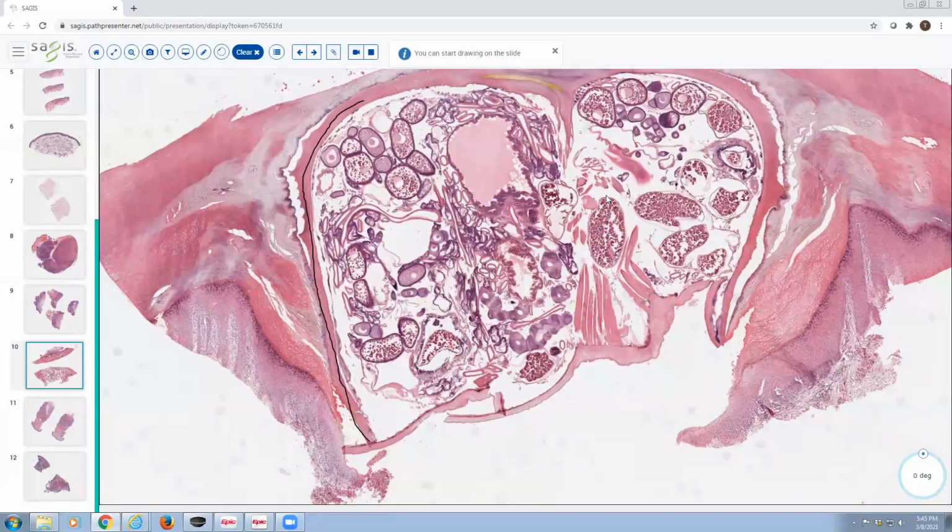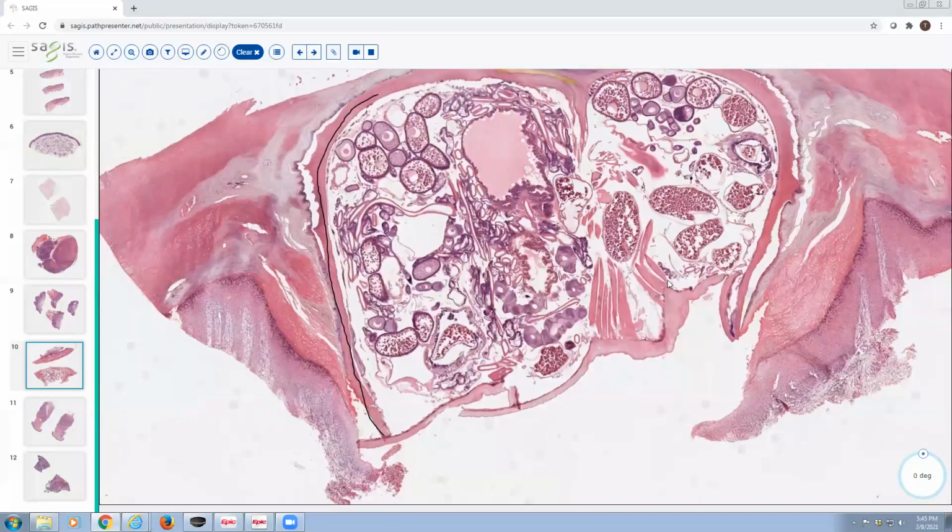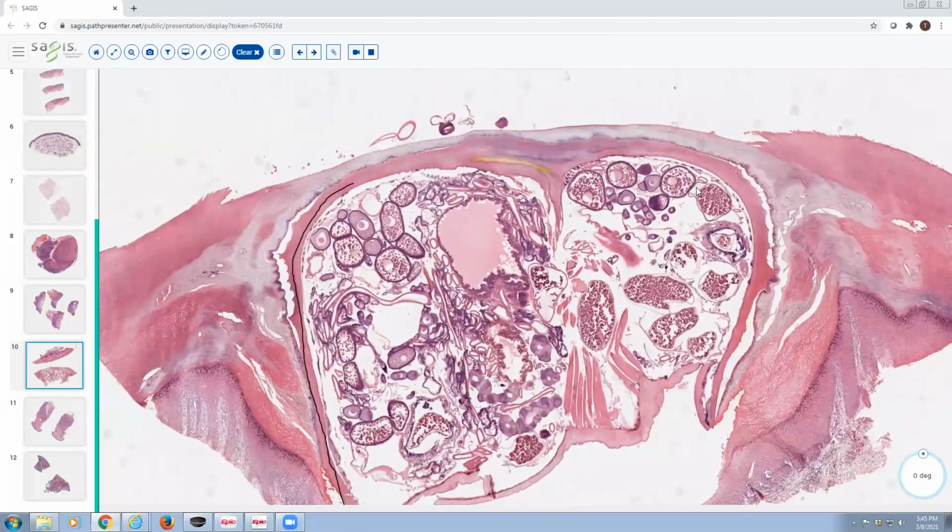So when I'm trying to distinguish this from myiasis, for example, or scabies, I worry less about what's on the inside than I do where is it located. And it's important to recognize Tungiasis being on acral skin.